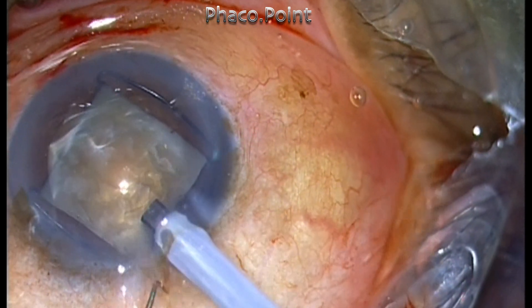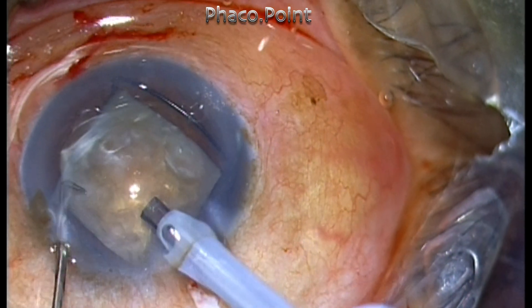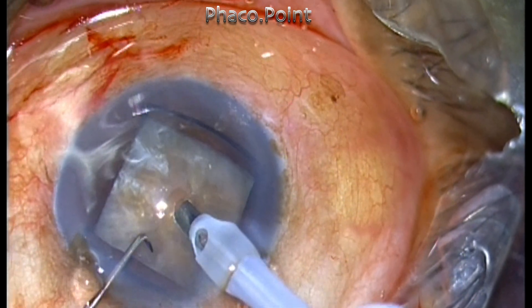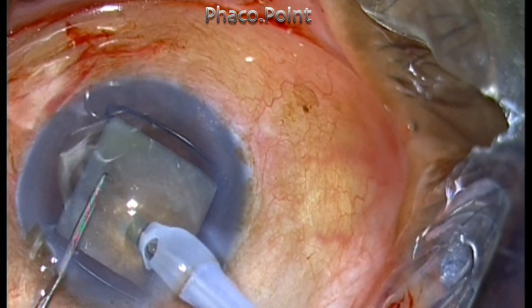As soon as I enter, I find there's conjunctival ballooning, so I make a small nick in the conjunctiva. Conjunctival ballooning, if not detected early, will build up and create a lot of problems later in the procedure. This nucleus management is totally unedited.